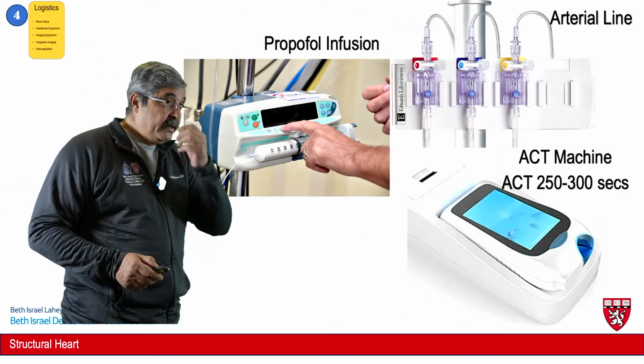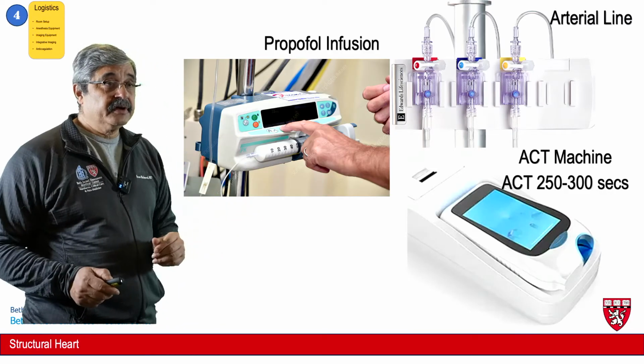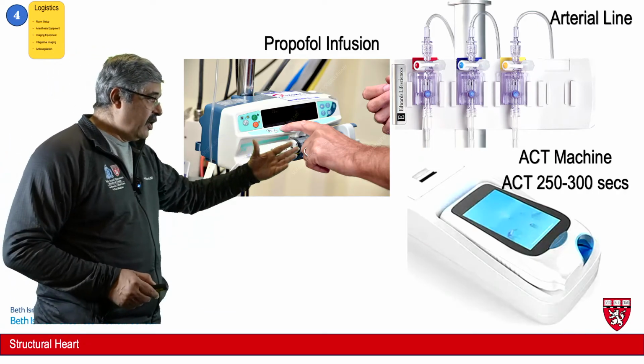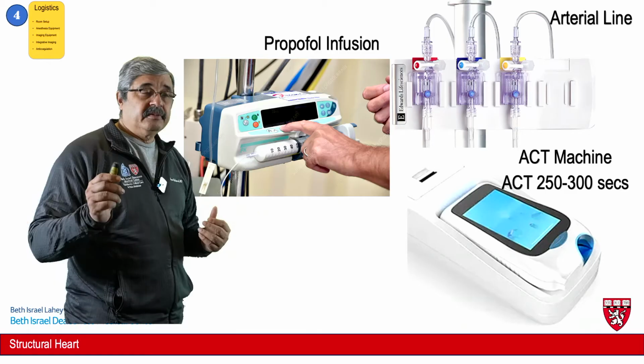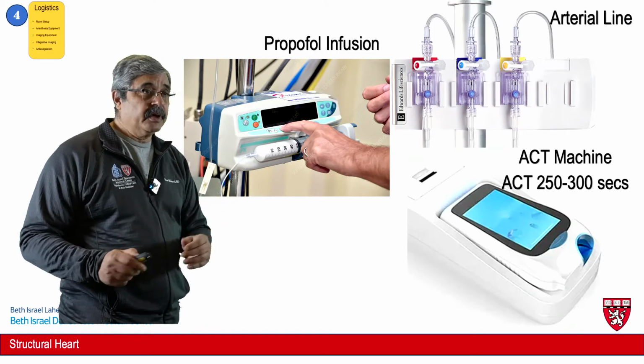At the same time, we have to have a propofol infusion, because in the middle of the procedure we convert to a total intravenous anesthesia when the patient becomes apneic. We have invasive monitoring lines, particularly an A-line. We run an ACT between 250 and 300, doing an ACT about every 15 or 20 minutes. That's the protocol.